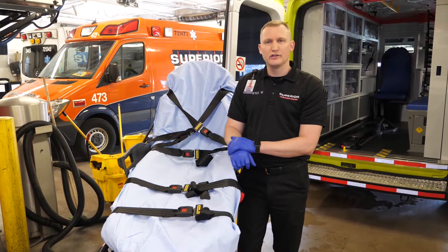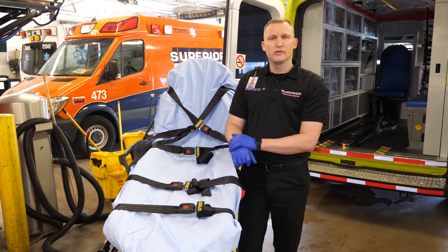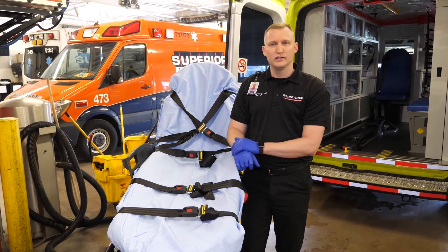That completes our decontamination process of the ambulance. As always, if you have questions, please refer to your station manager or you can ask the logistics department, as we are always here to help. Thank you for everything you guys are going through this COVID-19 situation.